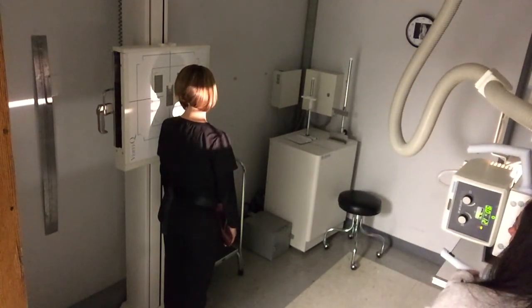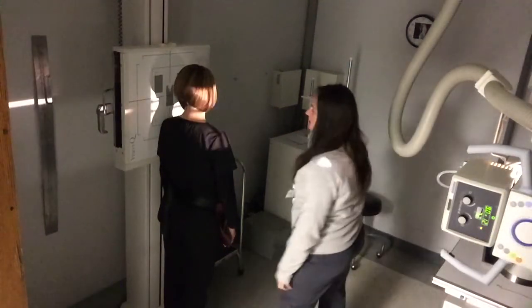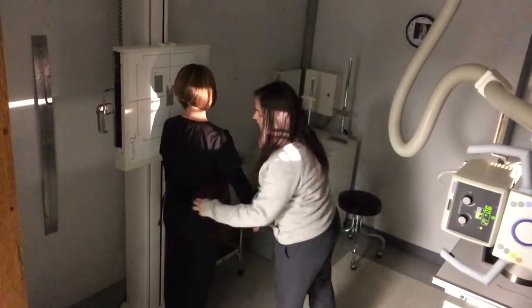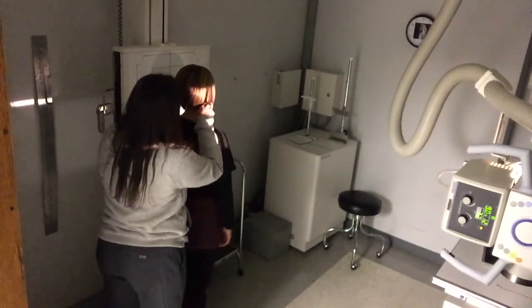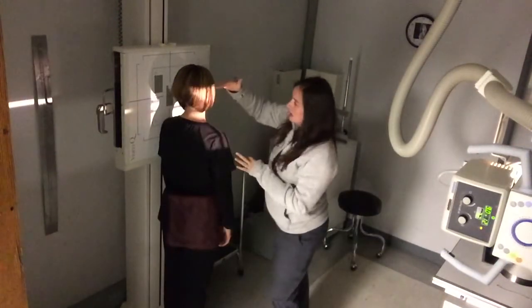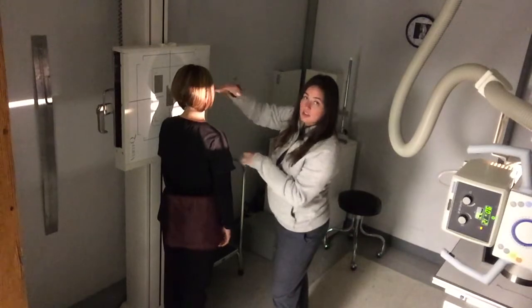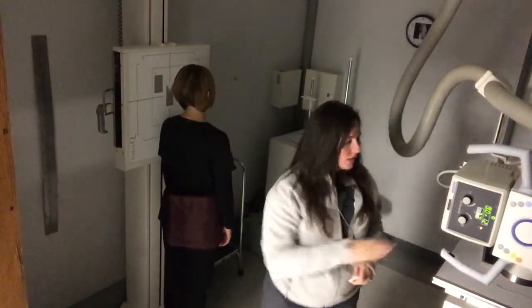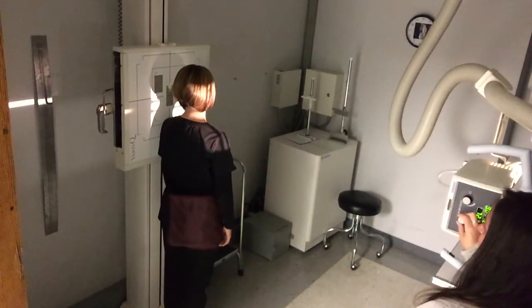Now for this one, it's the same centering. I'm looking right to the middle of her neck where her Adam's apple is, C4. I'm going to slide her shield around on her. Now, the best way to know how to collimate top to bottom is I'm going to look at her ear here. I want light just to the top of her ear and a little bit on her shoulder as well. So I'm going to collimate a little bit top to bottom because I don't need quite as much as I've got.